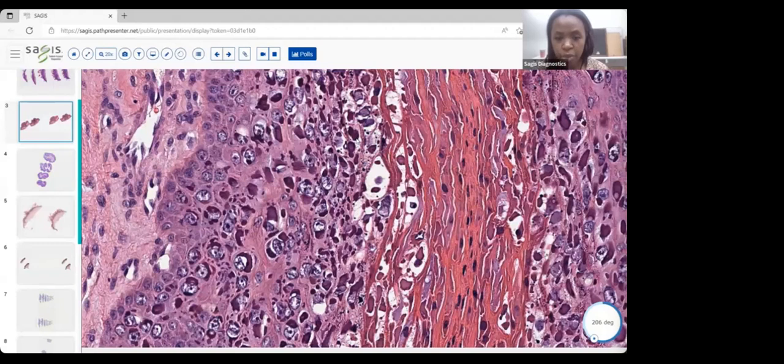They are really solid, really dense, and they're multiple. Okay, so we have these inclusions. We also have our keratohyalin granules, right? So we have cytoplasmic inclusions as well as keratohyalin granules that are enlarged. And in some places, we even have some nuclear inclusions as well.